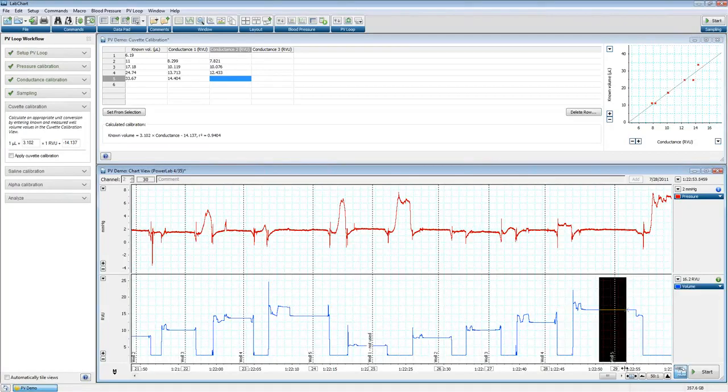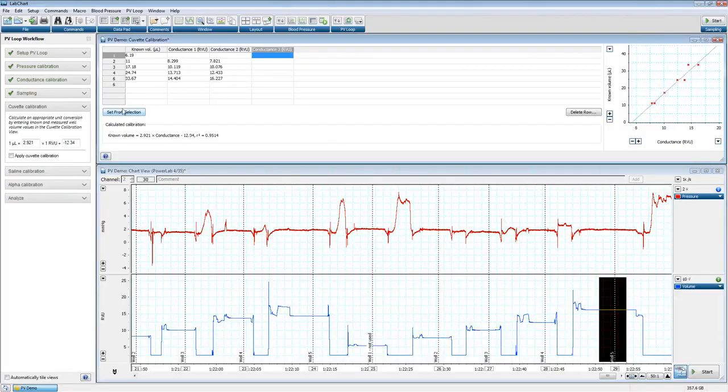And you'll notice too here as well the order that we're collecting this data. The cuvette calibration is at the very end because we're going to have to actually remove the blood volume from the animal to fill these cuvettes. And if we have something like a mouse, it's definitely not a lot of blood volume, and it's not going to be able to live without that. So we do this at the very end of the experiment. Saline bolus would occur before this, so you definitely want to record that data before.